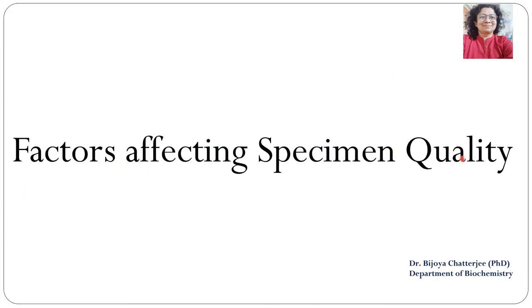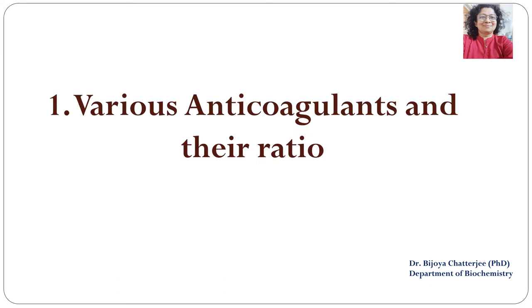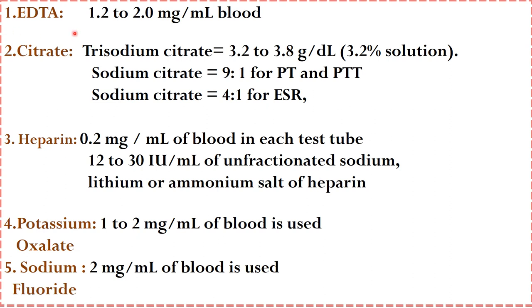Let us look at the factors affecting specimen quality. The first one is various anticoagulants and their ratios. For example, EDTA which has to be taken 1.2 to 2 milligrams per ml of blood, and if this ratio is not maintained then the blood components will be affected. There may be hemolysis and they may also interfere while carrying out the analysis.